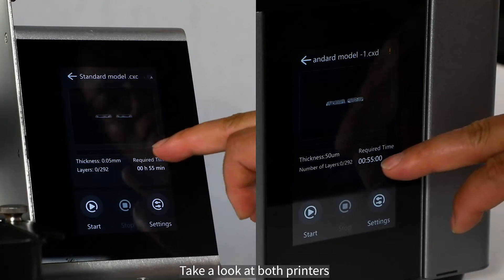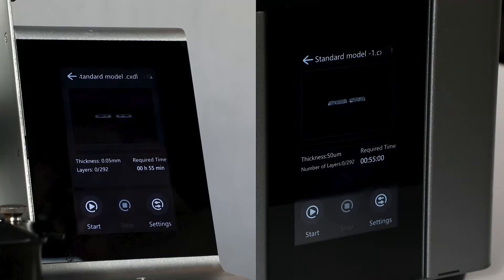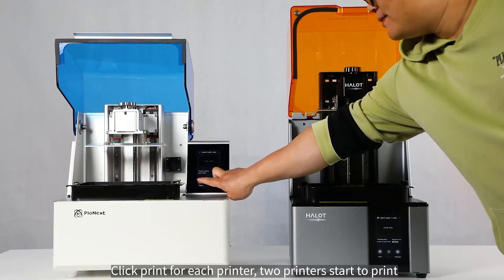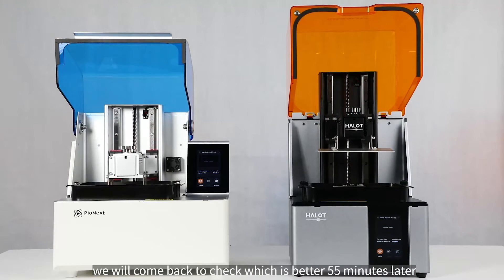Taking a look at both printers, we can see that both get the same number of layers and printing time. We click print for each printer, both start printing, and we will come back to check which is better 55 minutes later.